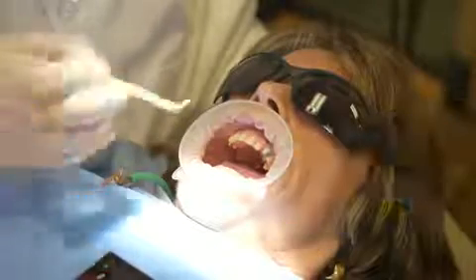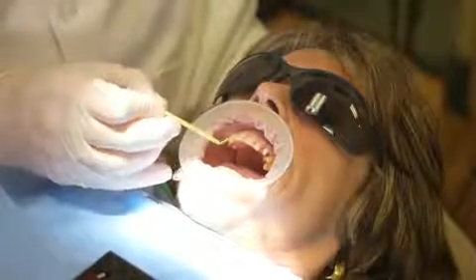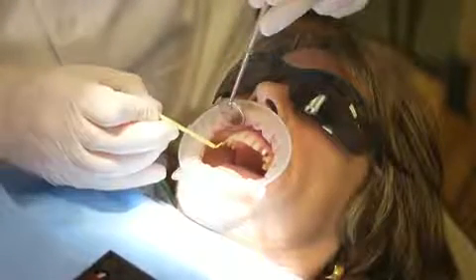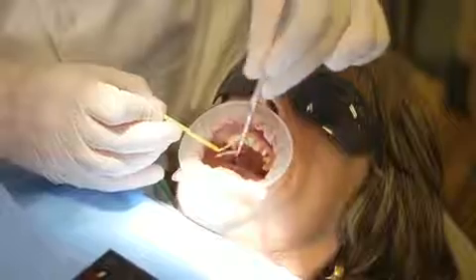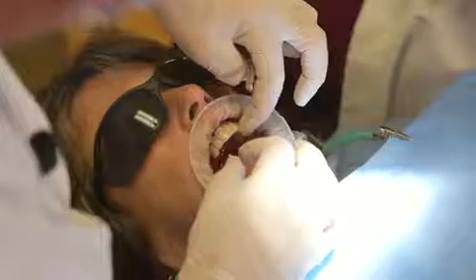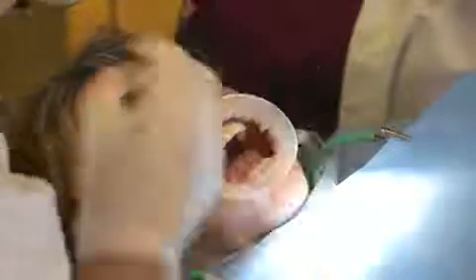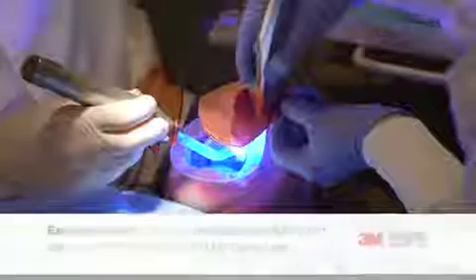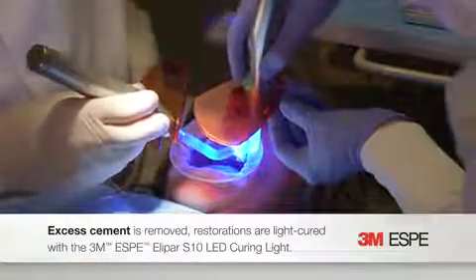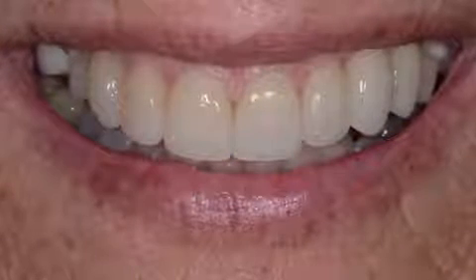When we bond these, we're going to use a fourth-generation bonding adhesive — Scotch Bond multi-purpose — and a translucent 3M veneer cement. This is called a rapid veneer seating technique, where we seat all these in one motion. We used two lights set for 20 seconds. The case fit beautiful — I didn't adjust a single restoration.